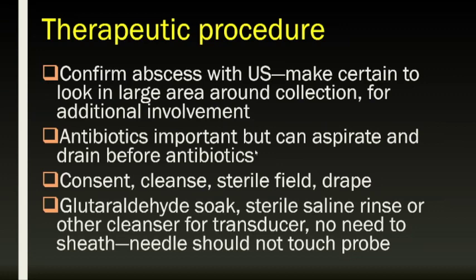It's important to get the pus out of the abscess, and then the antibiotics can be instituted. Written consent: cleanse the area with a sterile field, drape it, and then however you prepare and disinfect your transducers before use is what you need to do. There's no need to sheath these transducers.